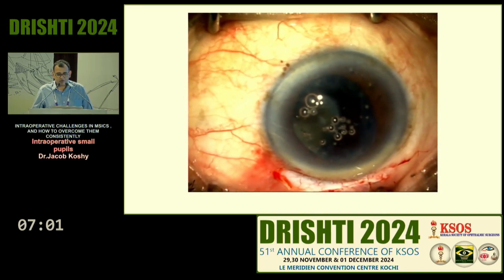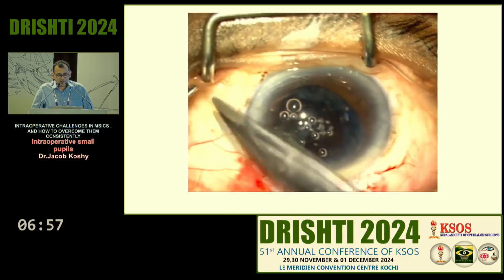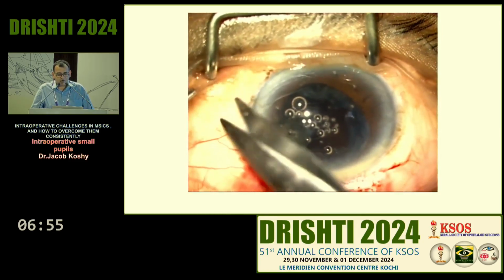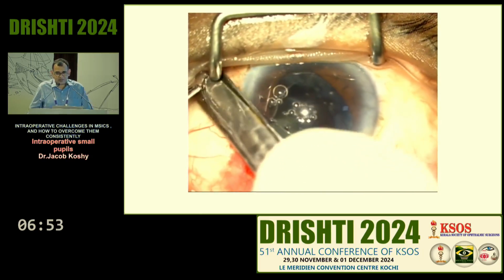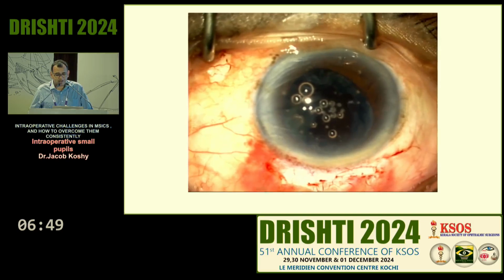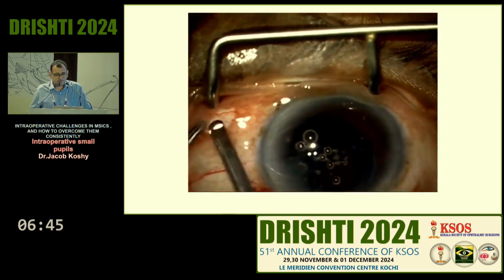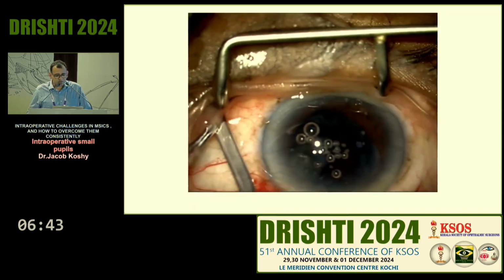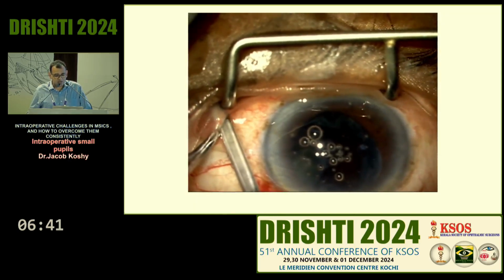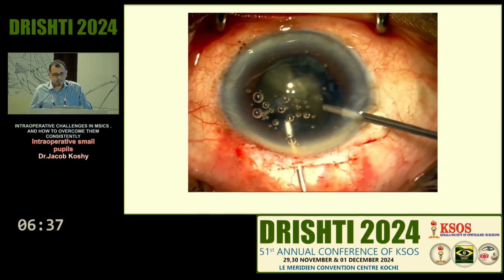Now, if the nucleus goes down, leave it, please send it to a VR surgeon. But here, I'm trying to handle it now. The block has worn off. Here, I'm planning to give a subtenon block to top up the block. Remember, if your block is not good, you cannot handle any of these things. Have a subtenon cannula, and it's a very easy procedure. Inferomedially, just go under the tenons, go deep and inject, and that acts immediately.